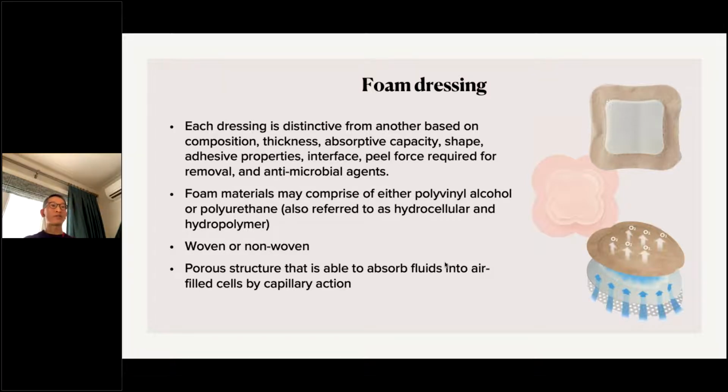It's a very distinct category of dressing material. It comes with many different companies. There are at least about 100 different types of foam material out there. They're different in terms of composition, thickness, absorbency capacity, different shape, and different location for different locations. The different adhesive properties, and because of the different adhesive they use or the location, it has different peel forces and potential for injury to the skin.